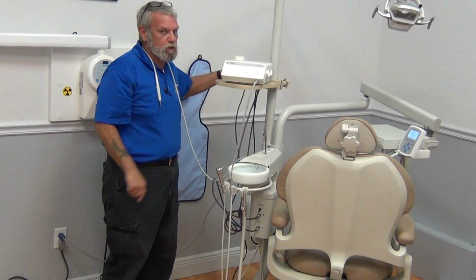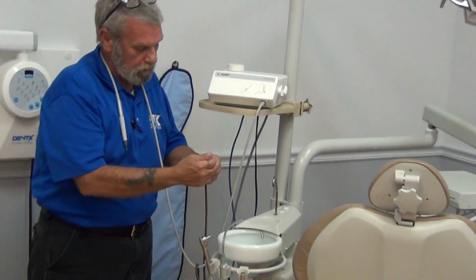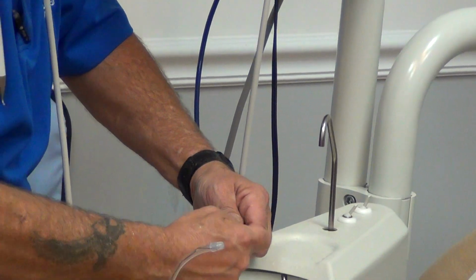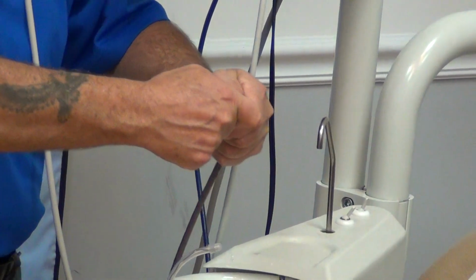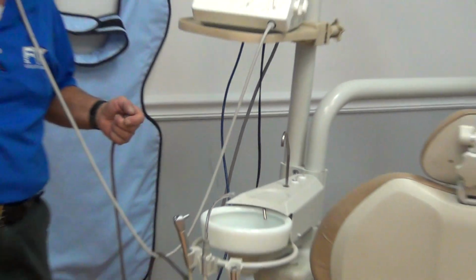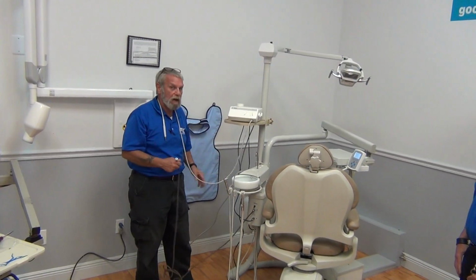Now, we hear the machine pressuring up. We hear the air rushing into it. We can do a repeat on the air tubing on this machine by simply doing the same procedure. My hands are wet, guys. To confirm air, if you hear it here, it's going to be in the machine. If you hear it all the way up to the machine, it's going to be the air solenoid or a valve. Most of the time, with the water problems on a Prophy jet, you have biomass.